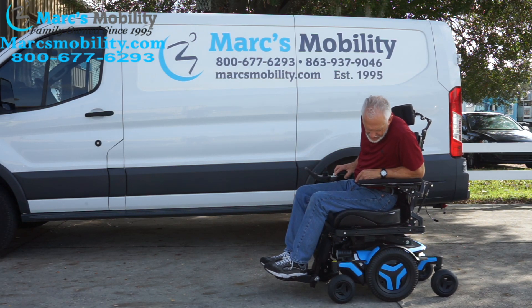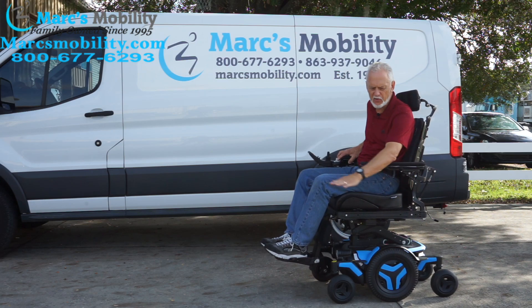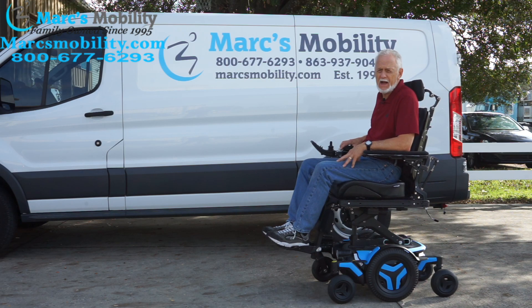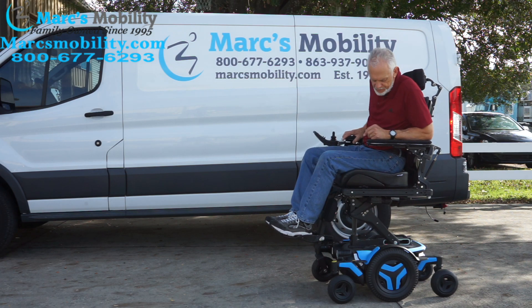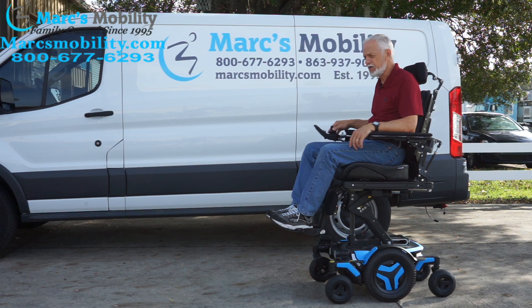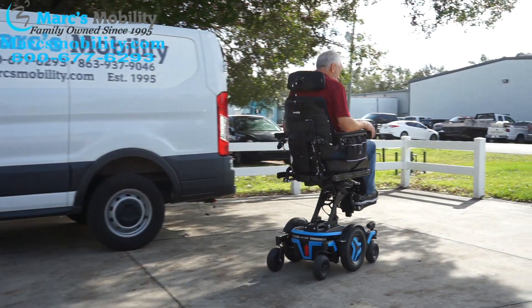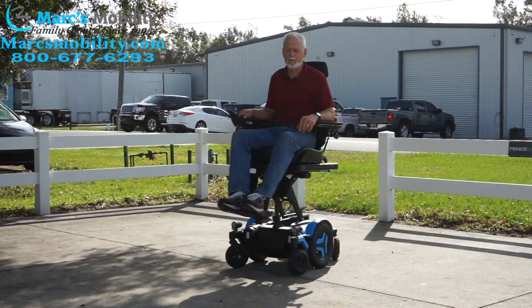Now I'll elevate the seat so you can see me driving the chair with the seat elevated. Remember: if you drive with the seat elevated, do it on a flat surface — nothing bumpy. This chair has 41 miles, practically new, with the seat lift, tilt, recline, legs, gel arms, and light package — fully loaded. With the seat elevated, the top speed is limited to 3.3 miles per hour.